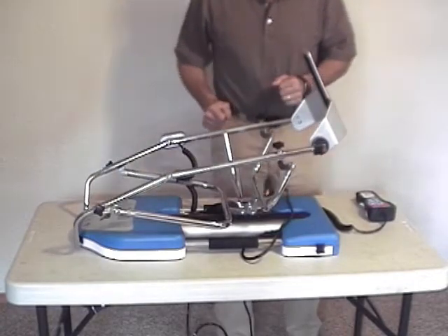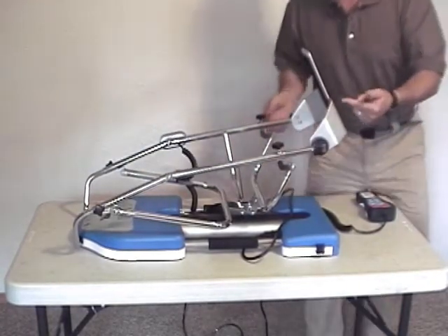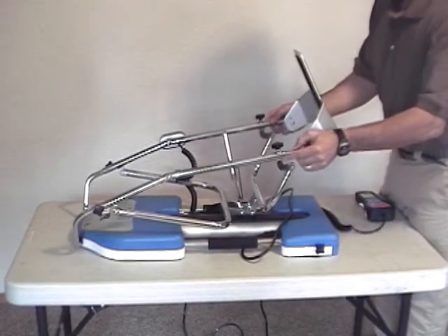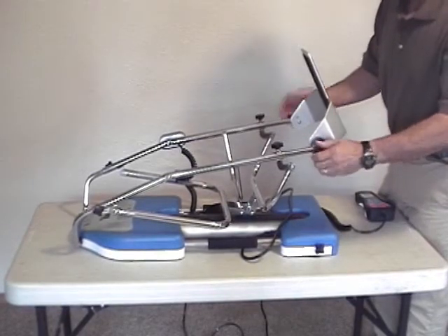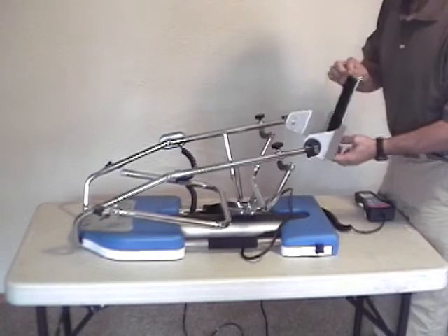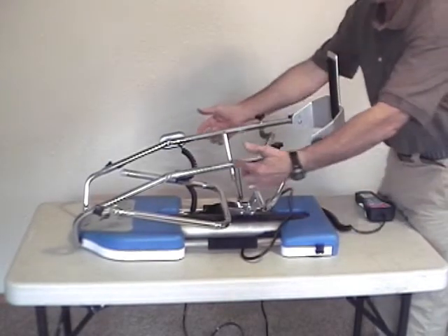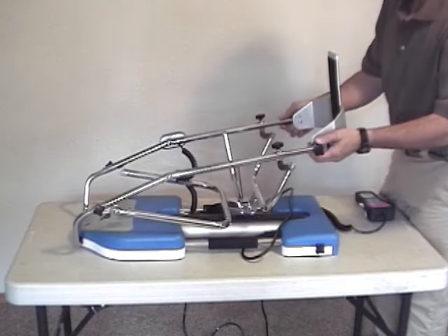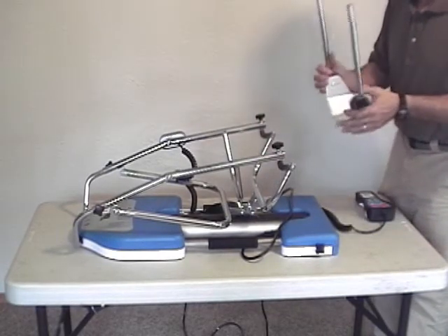Now for adjustments of the machine itself. You've got length adjustments for the lower leg, for the tibial portion — adjustments in and out, and adjustments for the angle of the ankle. Also note that you can shorten the length for your tibial adjustment by removing this section all the way and flipping it over.